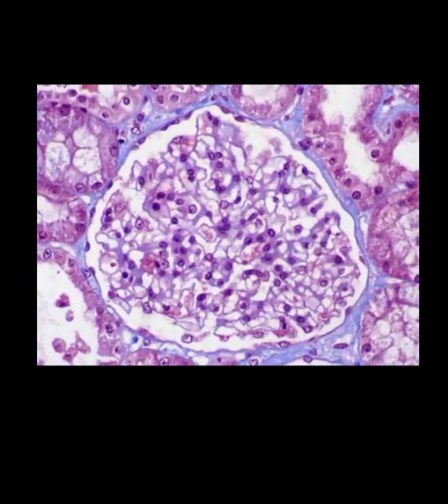So normal glomerulus can be in minimal change disease. It can be minimal change, IgM, it can be early membranous nephropathy. Yes, it can be IgA nephropathy. It can be thin basement membrane. It can be Alport syndrome. It can be lupus class 1 and 2. And it can be FSGS with a missed biopsy core. It can be early diabetic nephropathy.